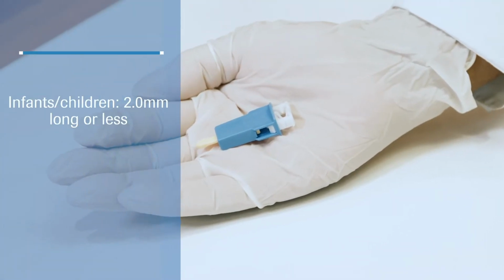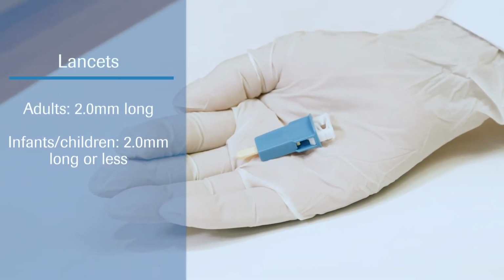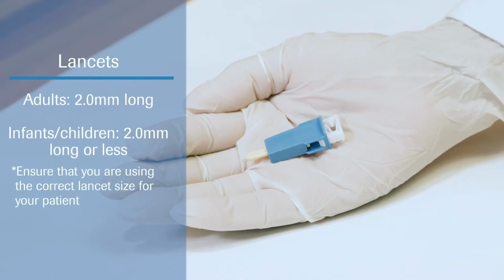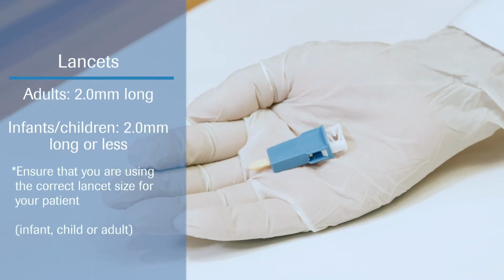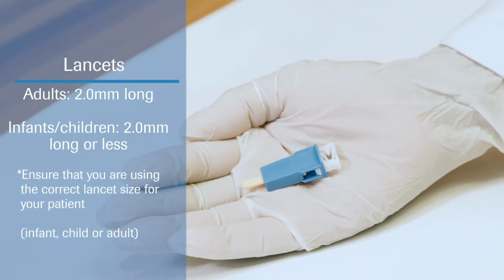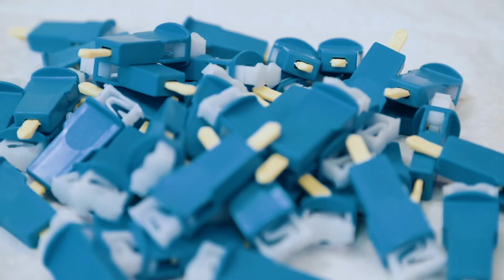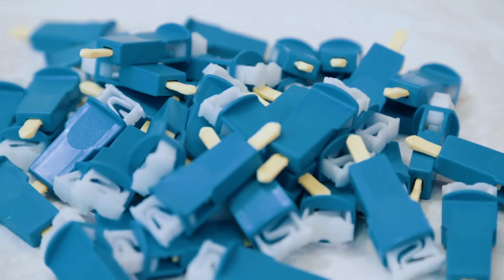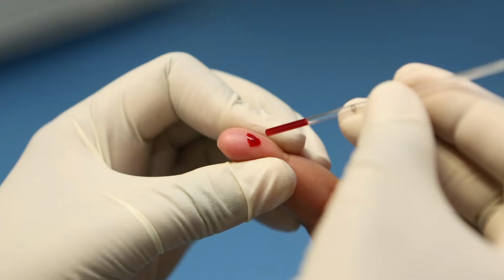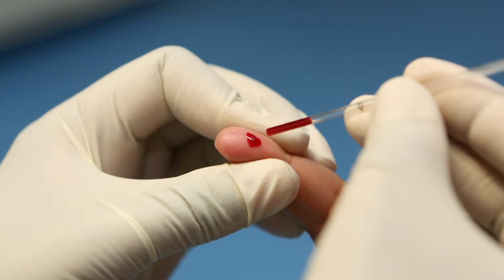First, you will need a sterile, disposable blade-style lancet or glucolet. The blade should be 2.0 millimeters long or less and 1.5 millimeters wide or less. This puncture depth is critical for all children. A 2 millimeter lancet is the correct length to puncture safely without damaging bone. You can also use a microcapillary tube for sample collection.